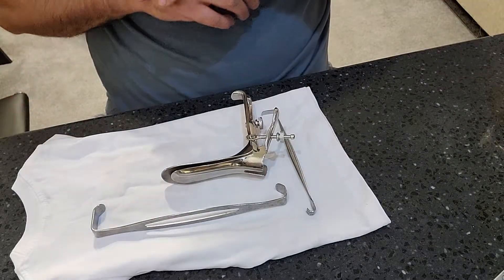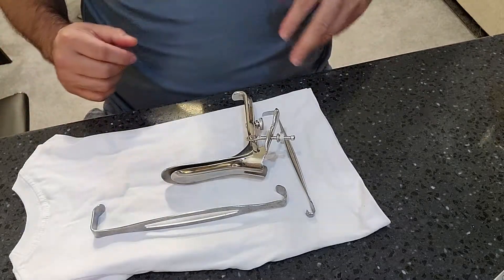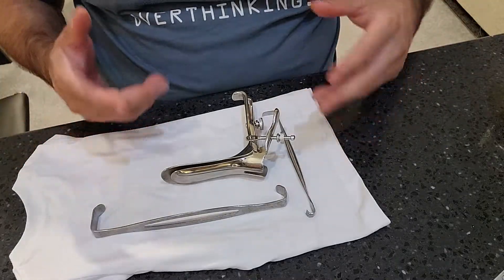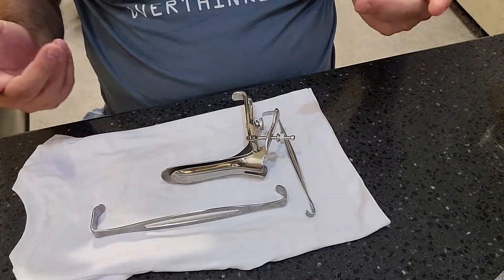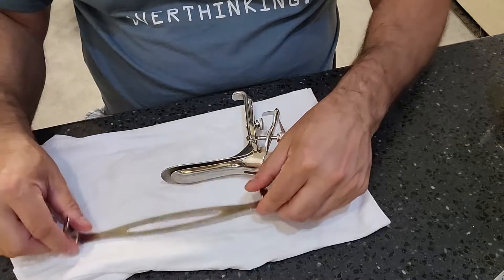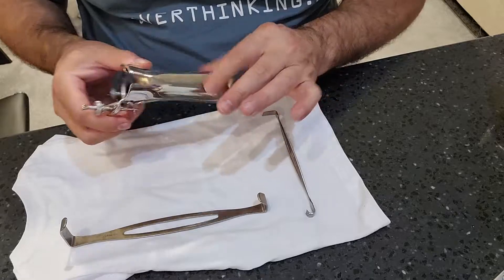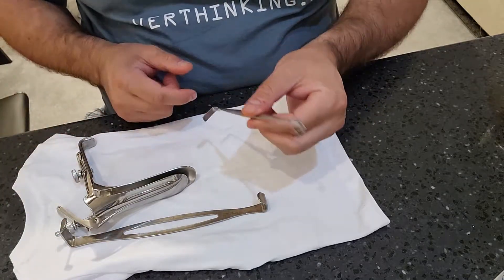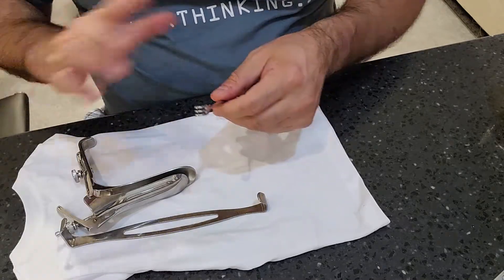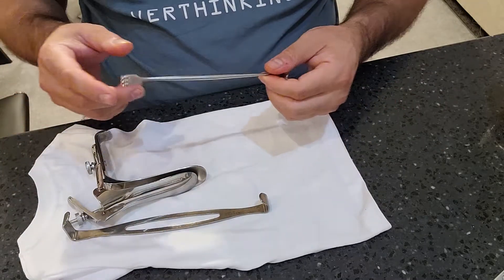There are so many different types of retractors in our industry — some you may have never come across and some you see all the time. I'm going to cover the ones we should be seeing on a daily basis. In my possession I have an Army Navy retractor, a Graves speculum vaginal retractor, and a Matthews retractor.